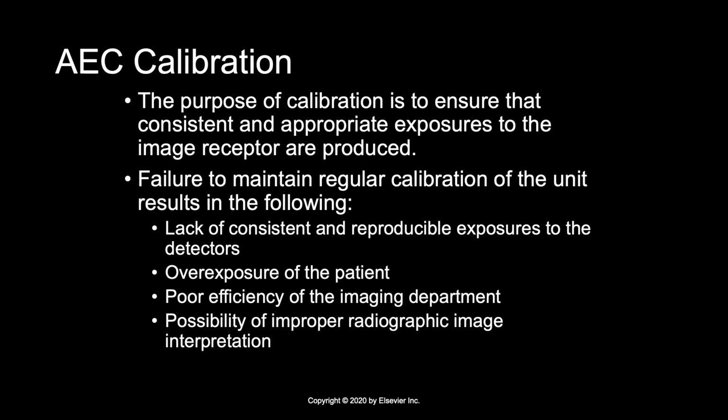Failure to maintain the regular calibration of the unit can result in 4 different things. Number 1, a lack of consistent and reproducible exposures to the detector. 2, an overexposure of the patient. 3, poor efficiency of the imaging department. And 4, possibility of improper radiographic image interpretation.